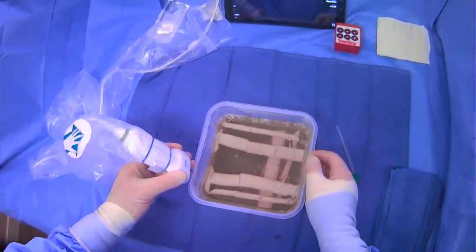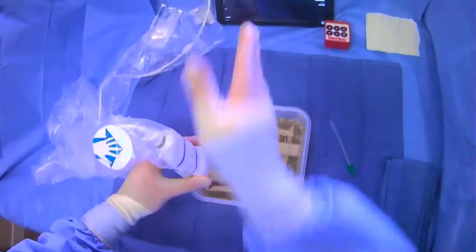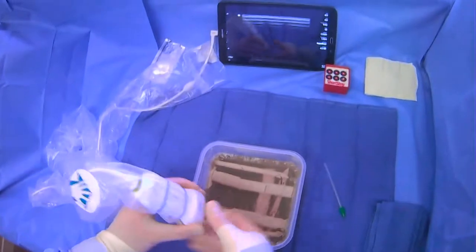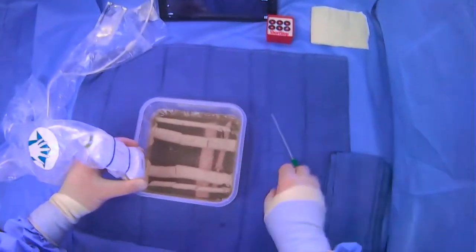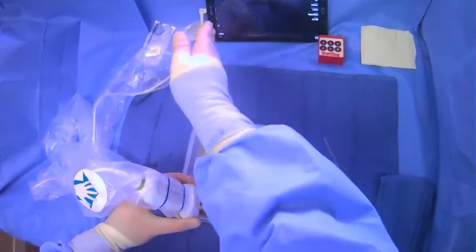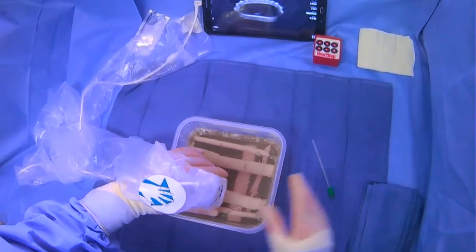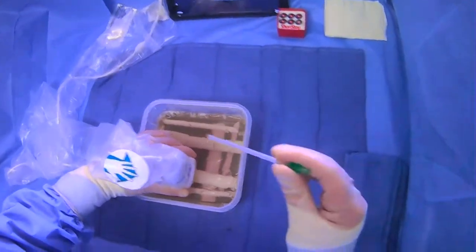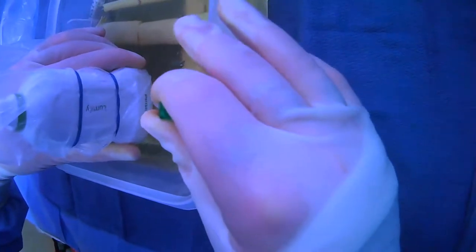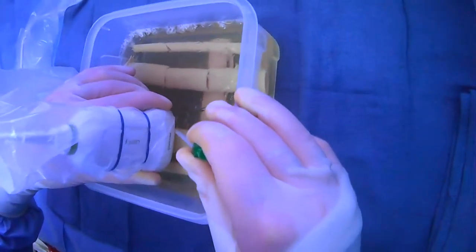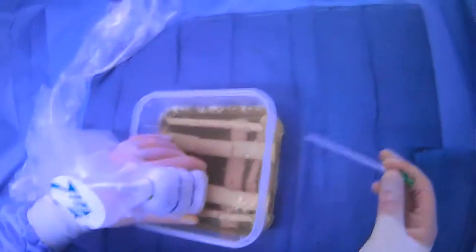So you may want to think about repositioning things. In this video, we're going to move the patient, but in real life, you would move yourself and where the ultrasound machine is to kind of maintain this ease of viewing the screen. So you may have to go on the other side of the patient. So now the patient's head is up here. Legs are down there. And you may have to move your ultrasound machine so that you can scan in the same plane. Let's find a good target here. And then now you can just come around here and gain access very easily. So the advantage of this is I can see the center of the probe here. Nothing is obstructing my view. I can go very close to the probe with my access needle. And personally, I think this has a lot of advantages because your fingers are not obscuring your view.